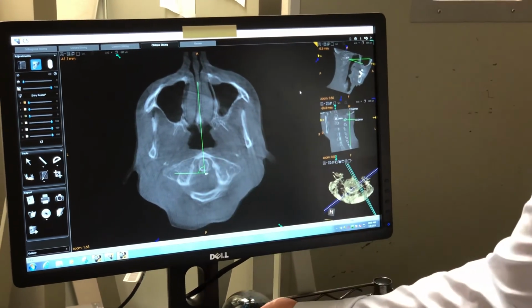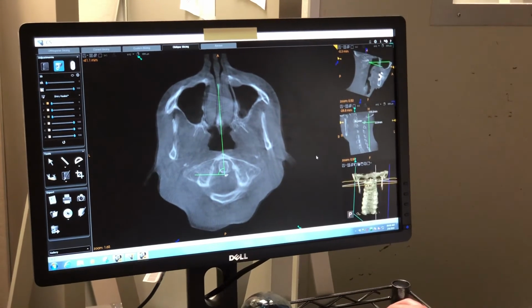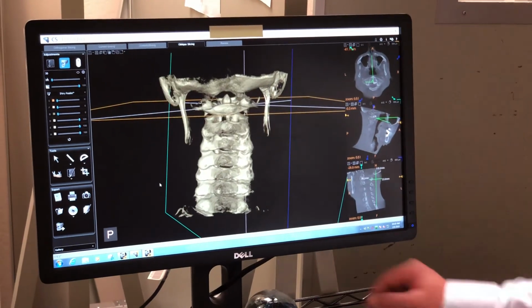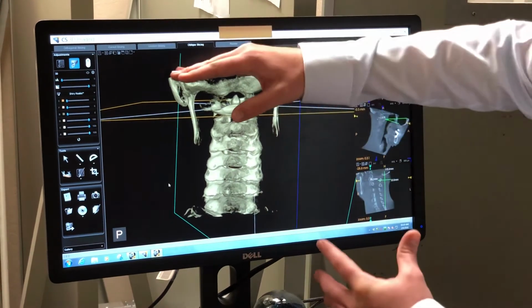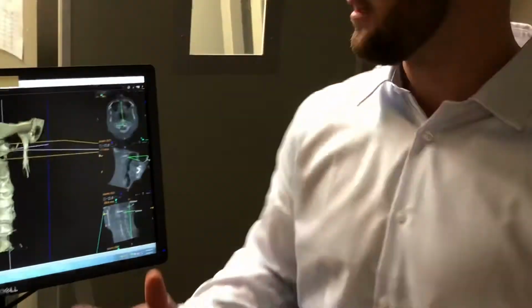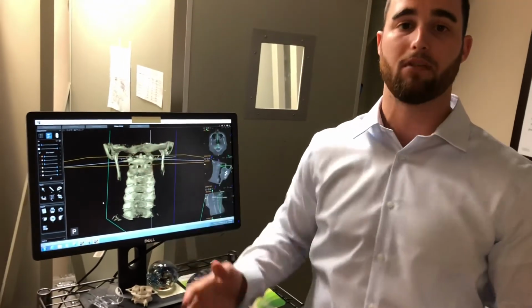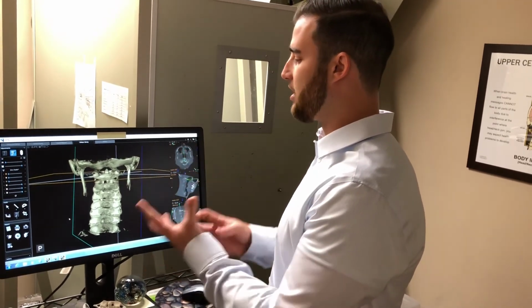And what that has done is, as that's thrown her head and neck out of proper alignment, the posture has changed, and that's putting a tremendous amount of stress on the rest of the neck, resulting in neck pain in the middle of the neck at this joint and this joint, because it's pulling from here at the top and here at the bottom. So in terms of what we're going to be able to do for her, now that we can see exactly what's going on, we're going to correct this alignment pattern at the top, remove some of that pressure coming down from the bottom, and this is going to be a much more comfortable, much more biomechanically correct neck.